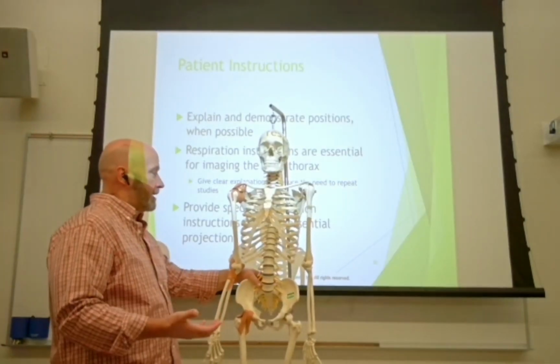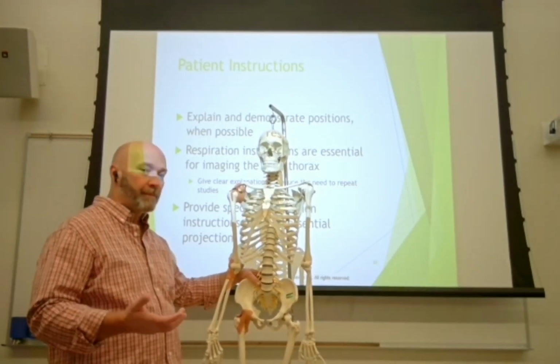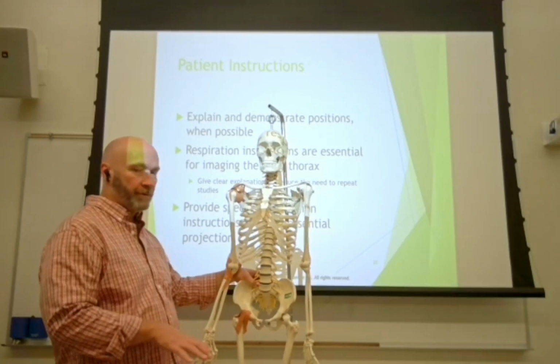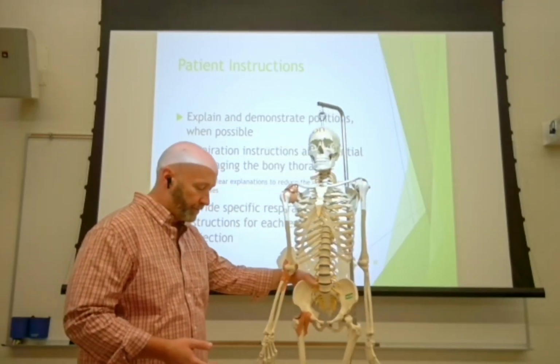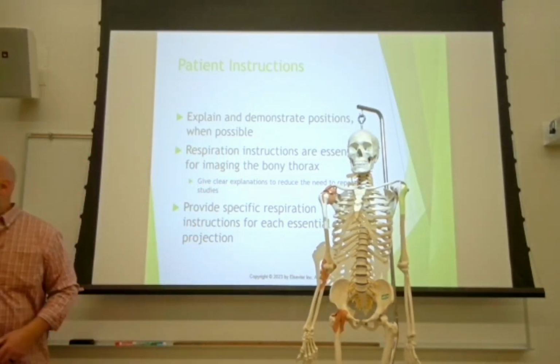So you want to have very clear instructions for the patient. Some of them are going to be breathing. Some of them are going to be holding their breath at the end of inspiration. Some will be holding their breath at the end of expiration. So be very clear with your patient, with your expectations for their breathing and their position.